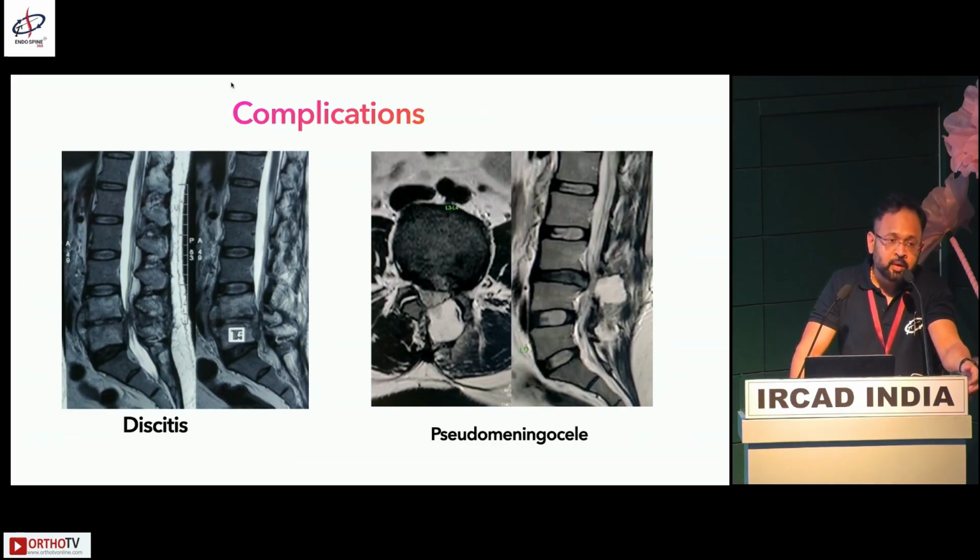Regarding complications, I feel they will come down if you follow the algorithm that Dr. Prasad sir tells, about antibiotics and so on. The only complication I had was 2 or 3 cases of discitis. Discitis is sometimes patient prone, we can't always say. It is not iatrogenic. I had a dural tear which I didn't see. Most of the dural tears intraoperatively, we are also suturing.